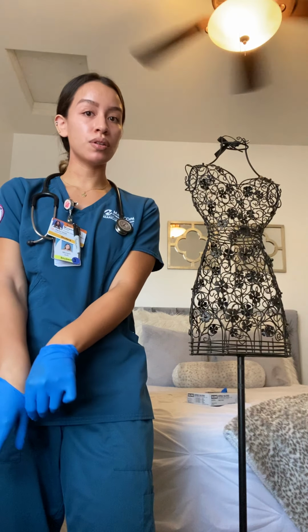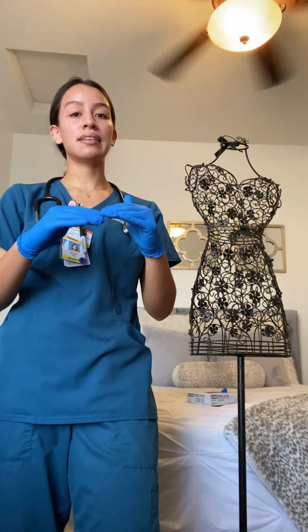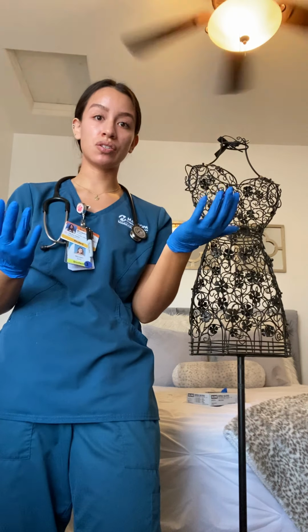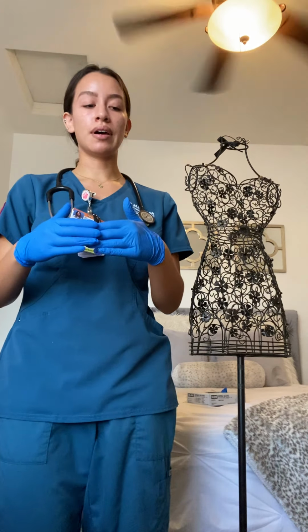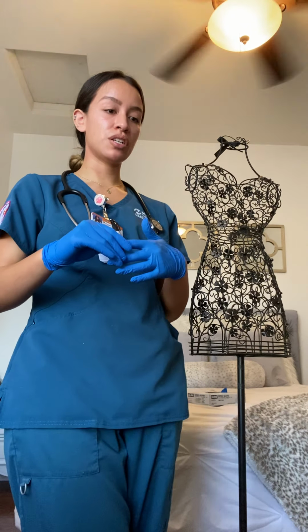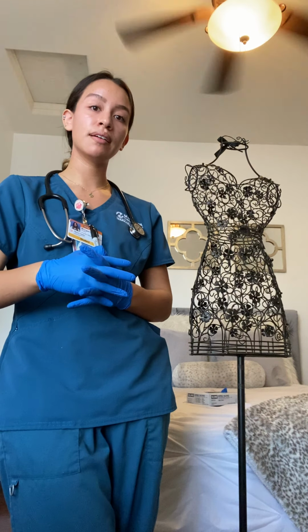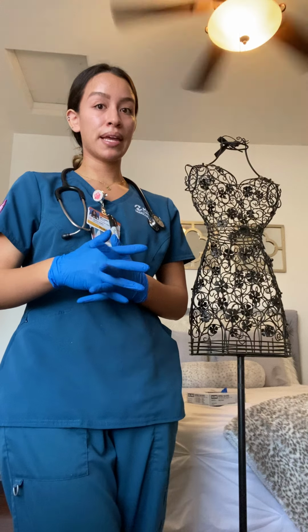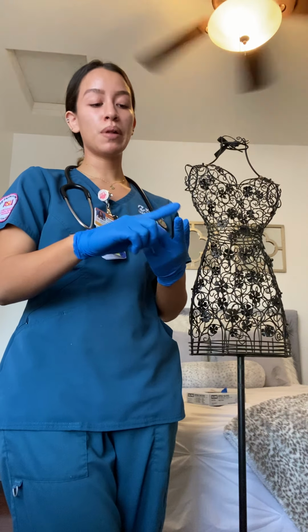I want to check her pulse, whether it's elevated, low, within normal range. If it is elevated, that could be a potential sign of, or a late sign of hemorrhage. Now, with hemorrhage, you will see elevated pulse and decreased blood pressure. So keep an eye out for that, but hopefully she won't be in that position. Hopefully we can prevent it before then. So I checked her blood pressure, pulse.